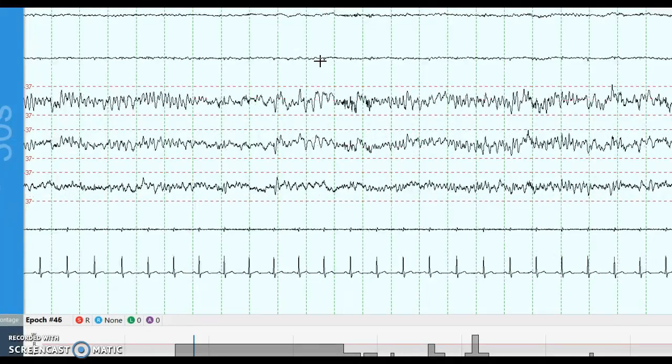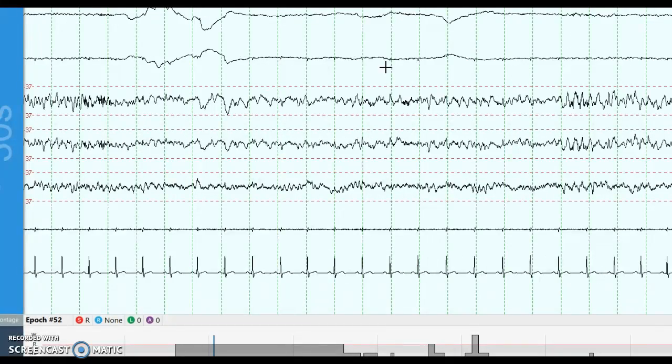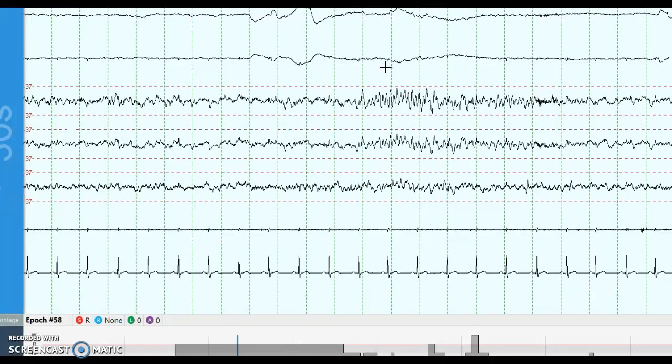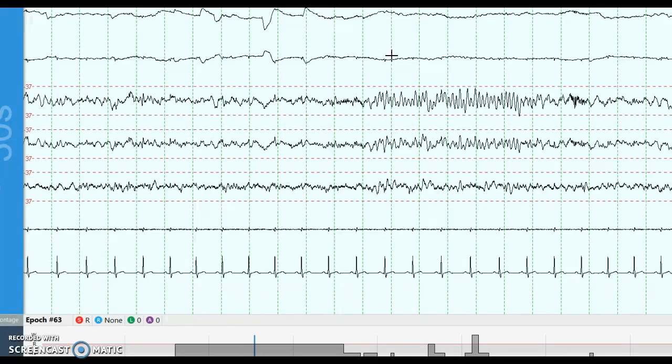As you go along, the eyes will show you a more typical example of the REM movement. It's really fun to watch, because as you see this typical rolling eye movement, the patient's eyes are rolling back and forth as they commonly do in REM sleep.